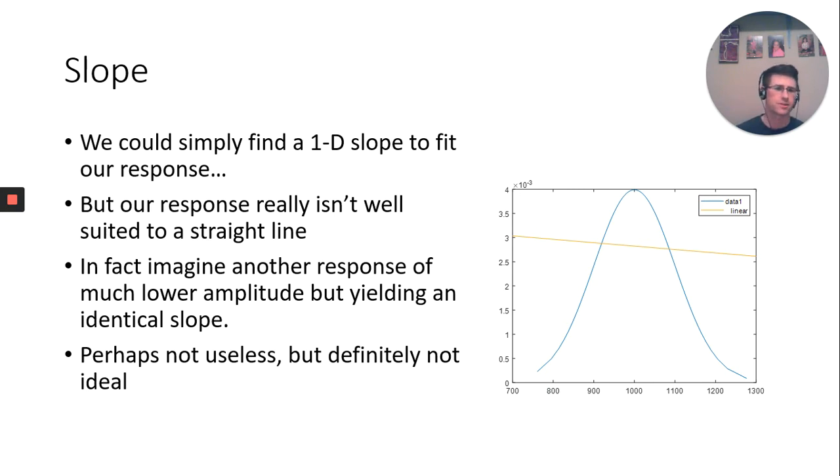Well, we could try slope, but as you can see, I fit a slope to this, and it doesn't tell you much at all. In fact, I don't think that really tells me anything. So not really useless. Some groups will focus on different time aspects of this and fit a slope to it. Maybe that's their thing of interest, their parameter of interest.